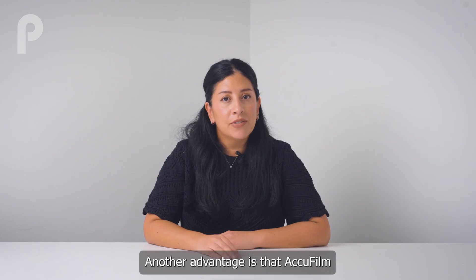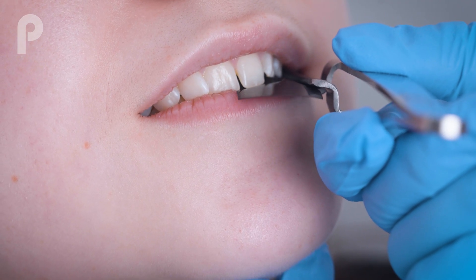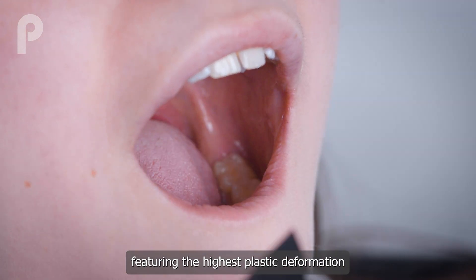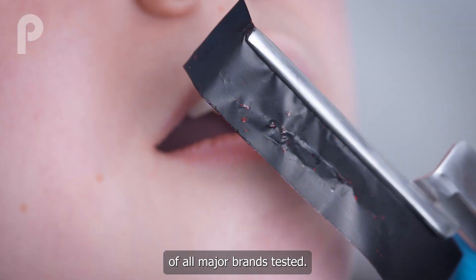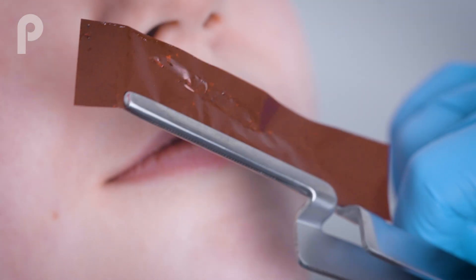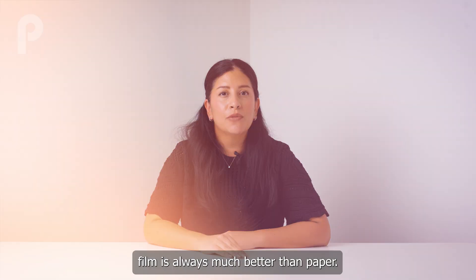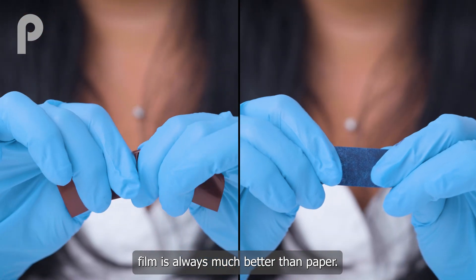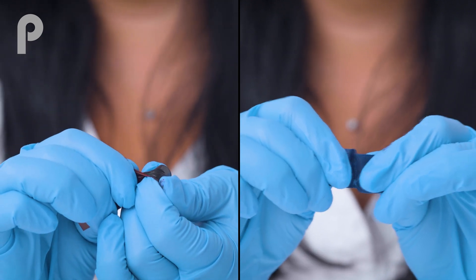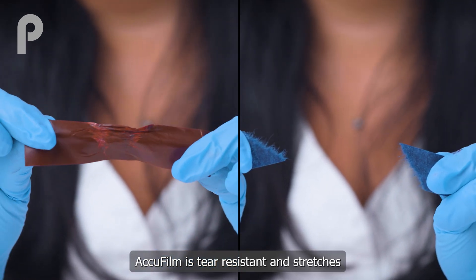Another advantage is that AccuFilm comes as a film rather than a paper, featuring the highest plastic deformation of all major brands tested. When it comes to articulating materials, film is always much better than paper. AccuFilm is tear resistant and stretches without breaking.